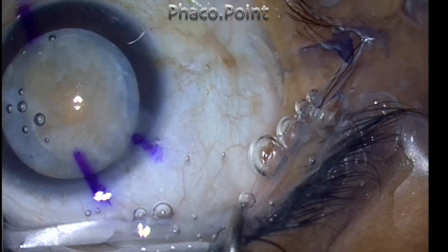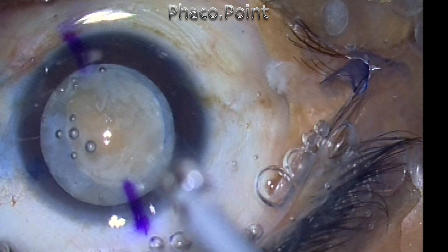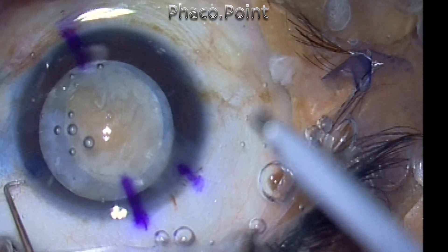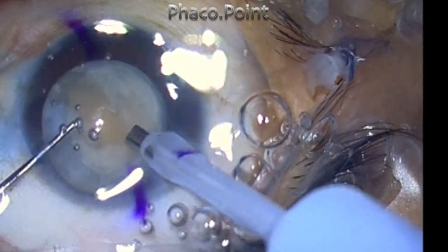Now this is what the sister gave me — a 1mm exposed tip. However, you need at least a 1.5mm exposure of the phaco tip to handle this type of cataract with the help of a direct chop. So let's move on to the actual procedure and I'll tell you some fine points by which you can go ahead with the direct chop in this patient.